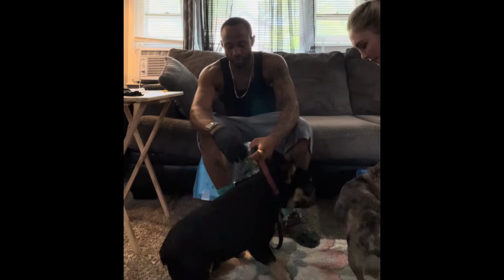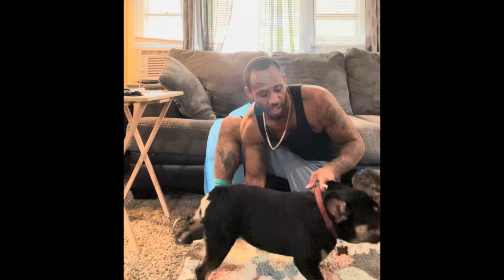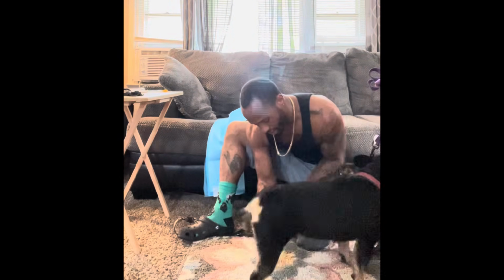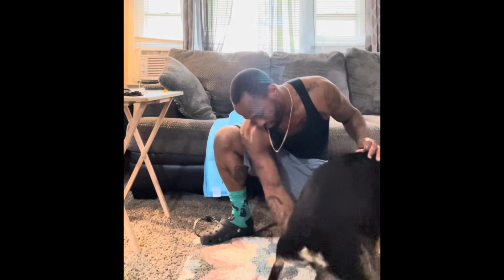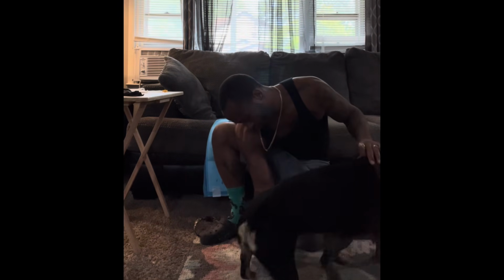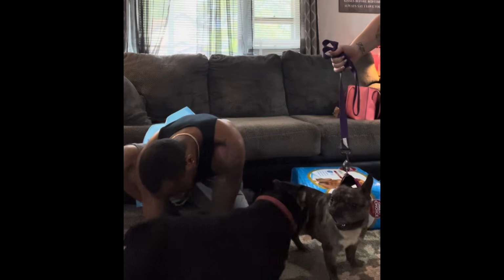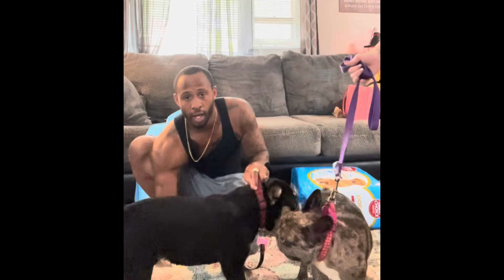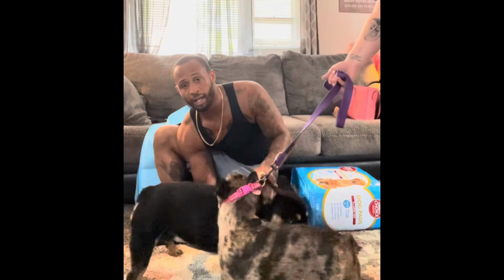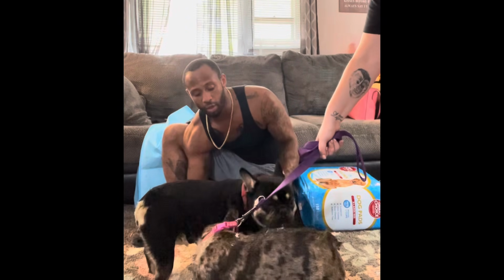Take this bag here, hold it like so. What you do is when you grab it, you will pull a knot, and then his balls, you want to grab in between that and let him go. Then you want to hold him for quite a while until he's fully done. And I usually hold him until I can see a clear liquid dripping in the bag, almost like water. As long as it's milky, you know that's the right sperm.